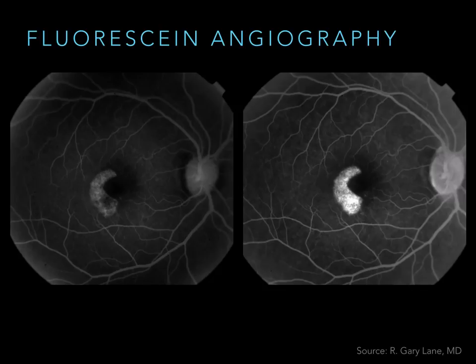So in this case, we see some hyperfluorescence in our first slide on the left. And on the second one on the right, it's brighter, but it's not expanding beyond those borders. So anybody want to say what it is? Sam, what do you think? We're not going as far as a clinical diagnosis. Do you think it's staining, leaking, pooling? Definitely not leaking. There you go. So it's staining.